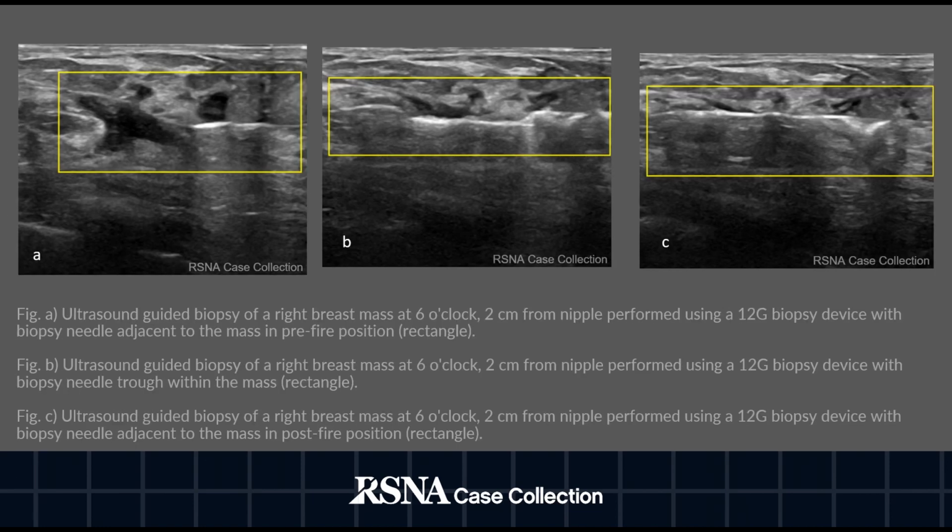The patient underwent ultrasound-guided biopsy of the mass. The left image shows the biopsy needle adjacent to the mass in pre-fire position. The middle image shows the biopsy needle trough within the mass. And the right image is a post-fire image.